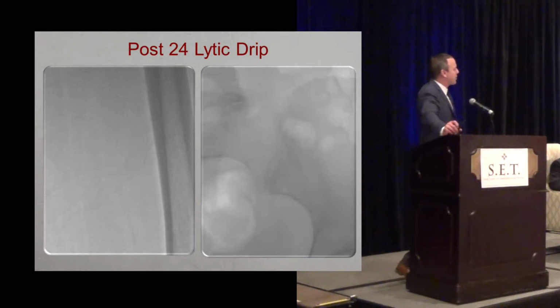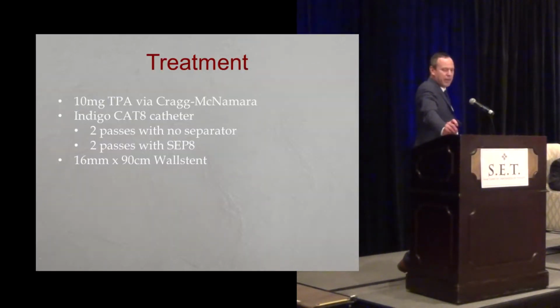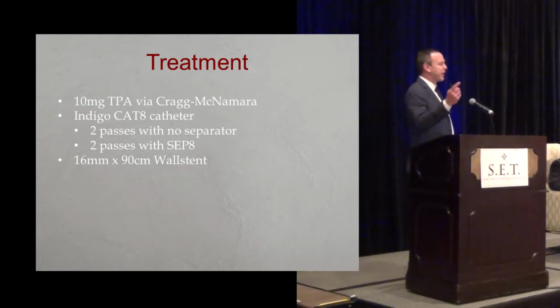So instead of dripping her some more, we actually went through with the Cat 8, and in about a couple passes through here, we infused her with another 10 milligrams of TPA through an infusion catheter, took the Cat 8 up. It comes with a separator as well, or without a separator. Most of the time in large clot, I go without the separator and just spin the catheter to help macerate it. I see what I get.